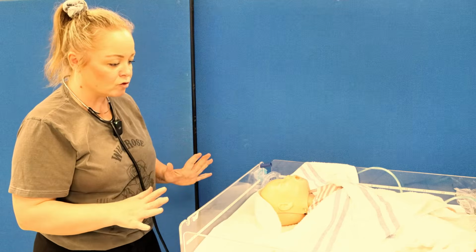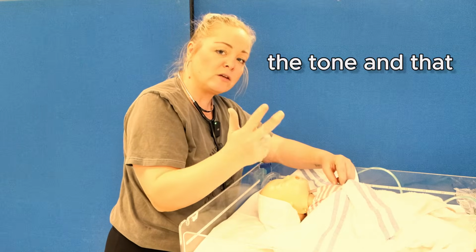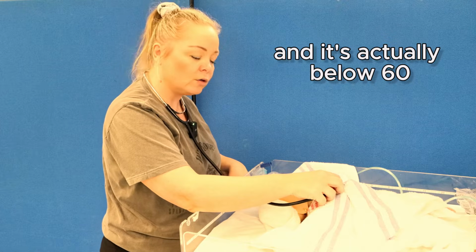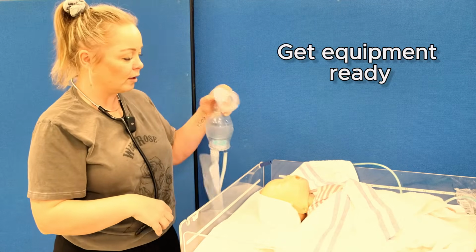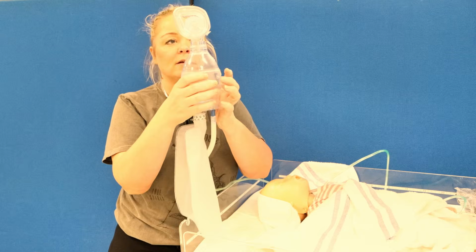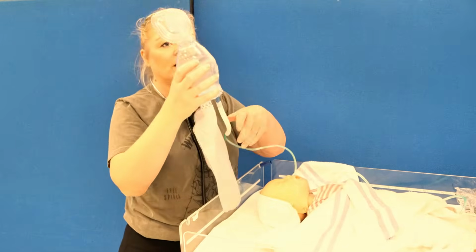So, baby's dried, stimulated, and nice and warm. I've checked the colour, the tone, and that they're not breathing. I'm now going to check their heart rate, and it's actually below 60. So I know I need to help baby at this point. So the first thing I'm going to do is get my equipment ready. I've got my bag valve mask. This is your bag. There's a little valve inside. So unless you squeeze the valve, we're not delivering any oxygen. And then the mask at the end.